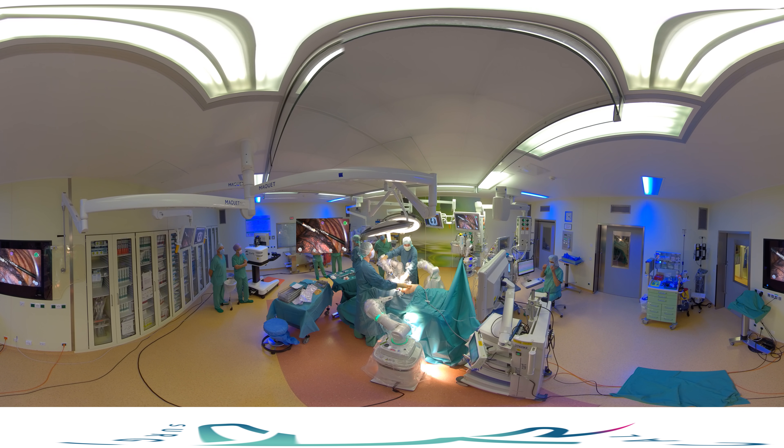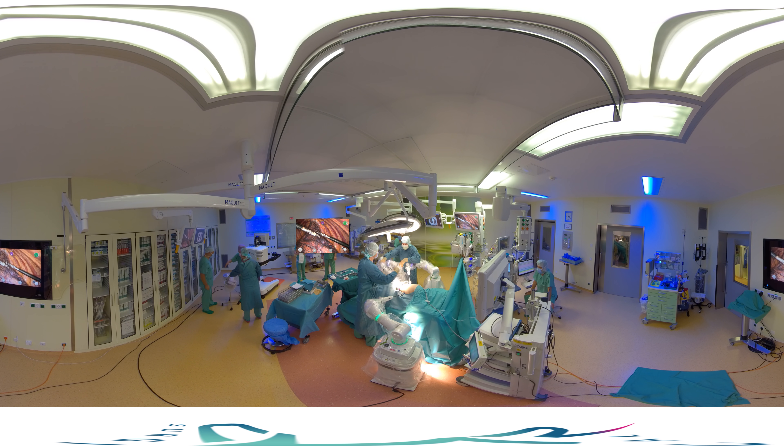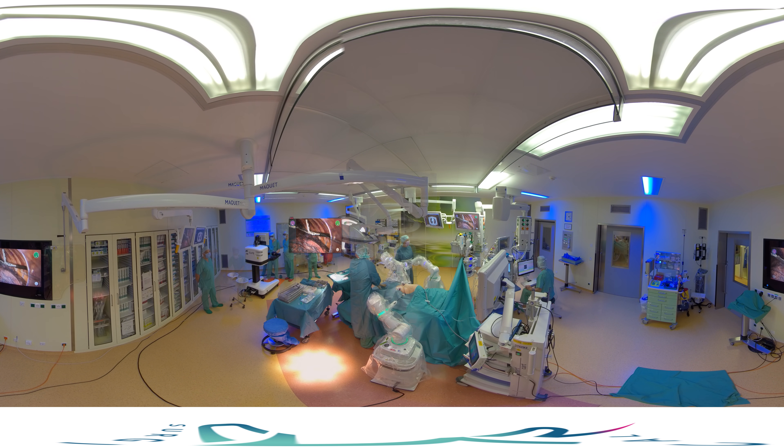We are now doing what we call port training. To train the port, the instrument is inserted into the port just until you see its tip, and then by moving the arm until the ready sound is heard.